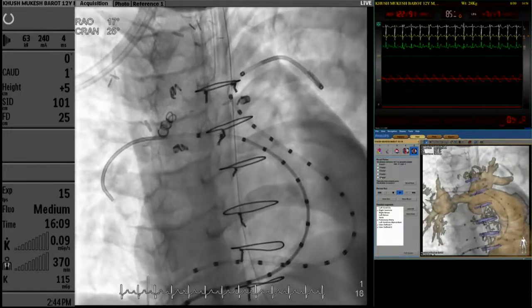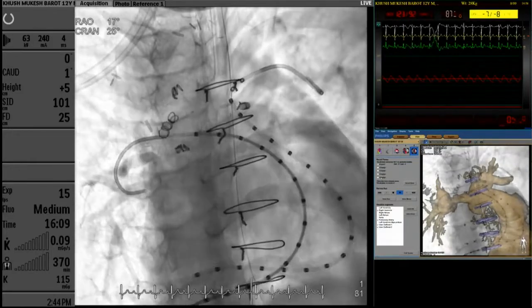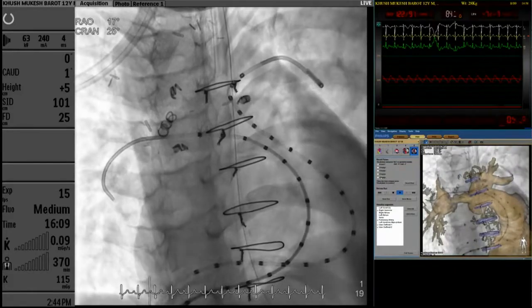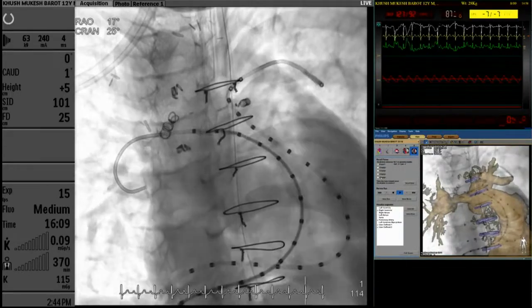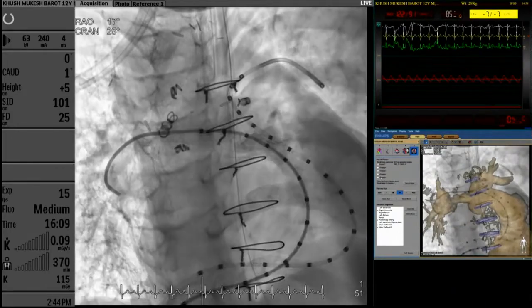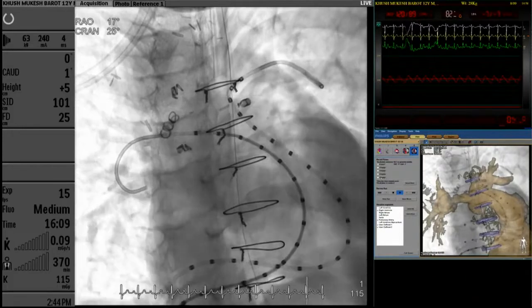In this particular angiogram, we can see that the metal clip on the right pulmonary artery area is indicating where the bifurcation is. So if our stent is going to be just abutting that metal clip, can you see it? One oblique metal clip. If you are abutting that metal clip, I think we should not be encroaching into the branch of the right. So there are certain landmarks.